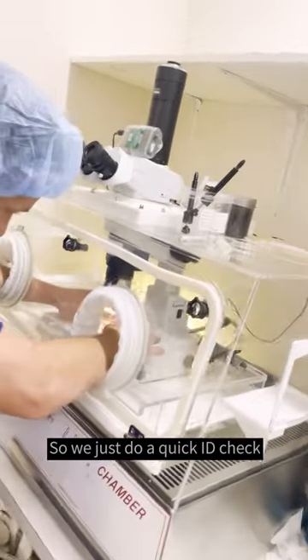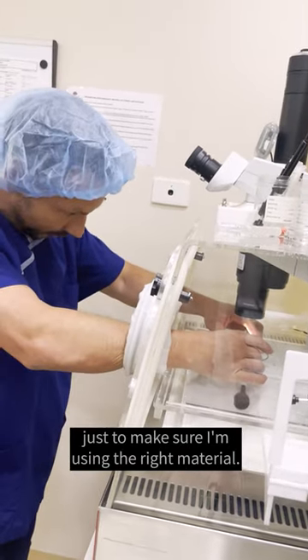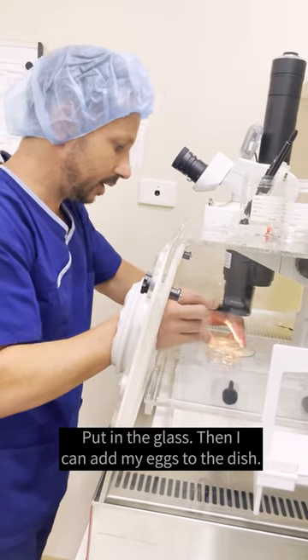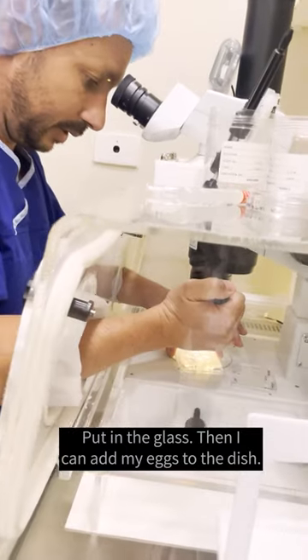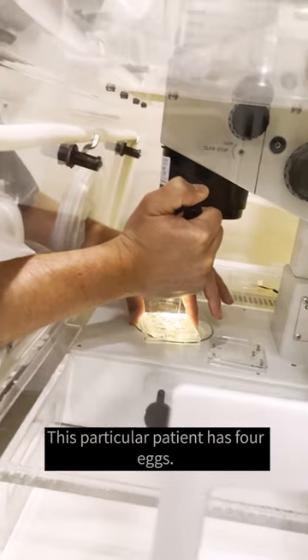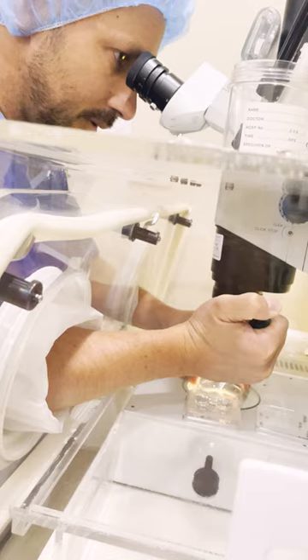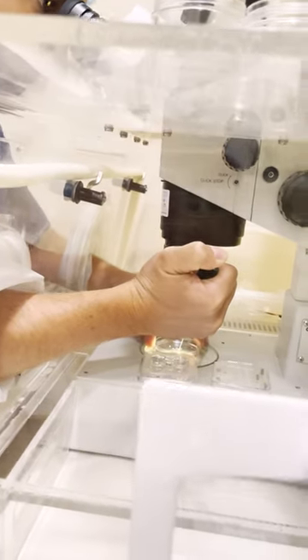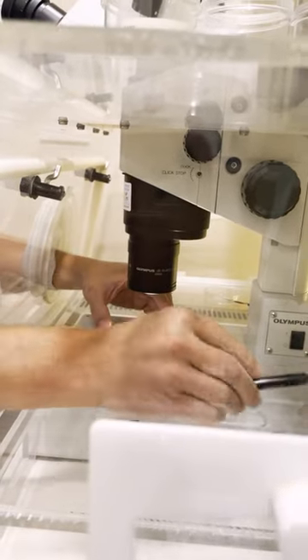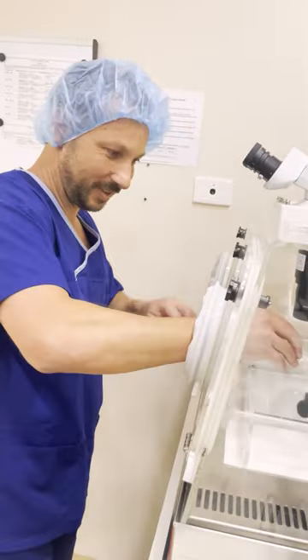So we just do a quick ID check just to make sure I'm using the right material. And then I can add my eggs to the dish. This particular patient has four eggs. So we've got both the parts we need to make a baby in there. Now we're going to put them together.